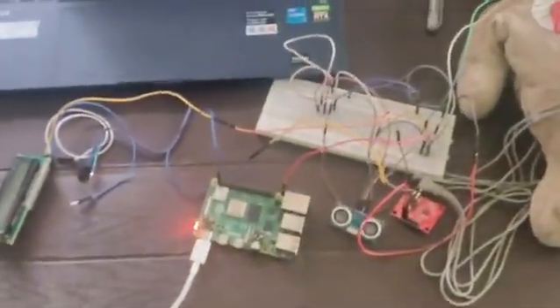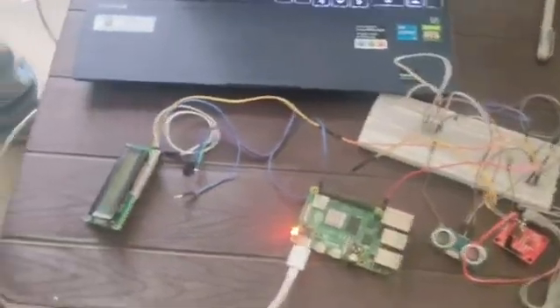First, the Raspberry Pi. The Raspberry Pi is the main control, the brain of the system. It collects the data from the sensors, processes real-time data, sends the data to the dashboard, and controls the LCD display and the alert system.